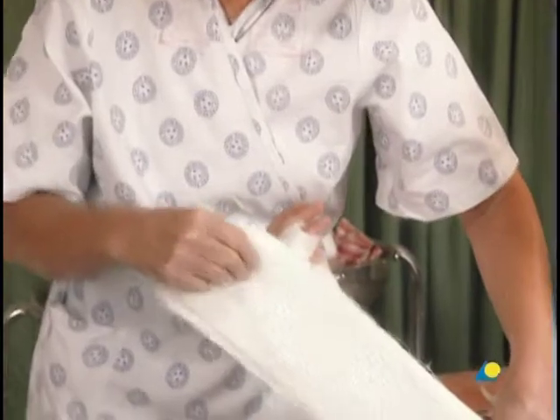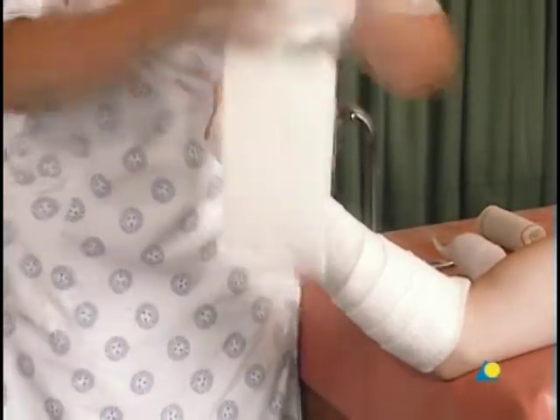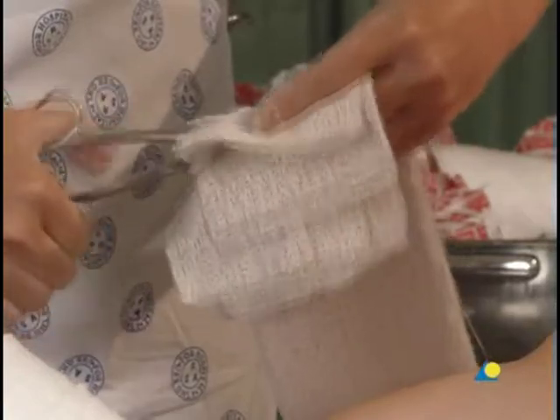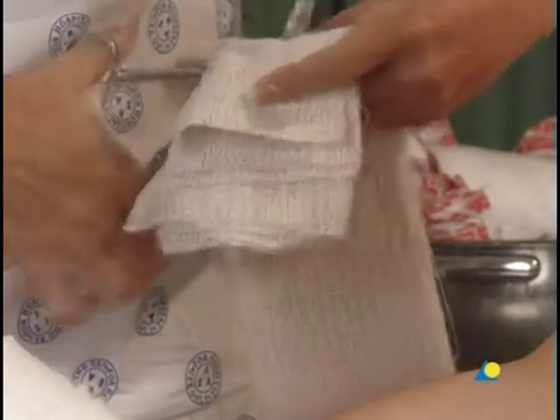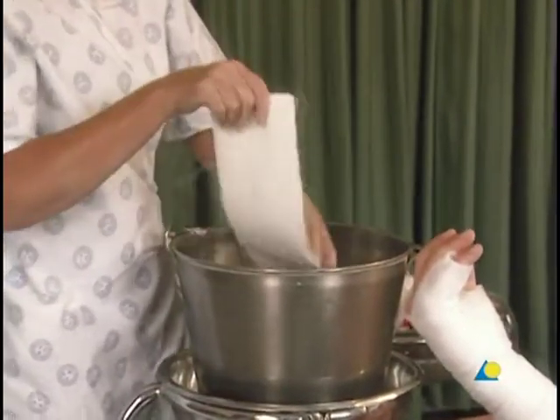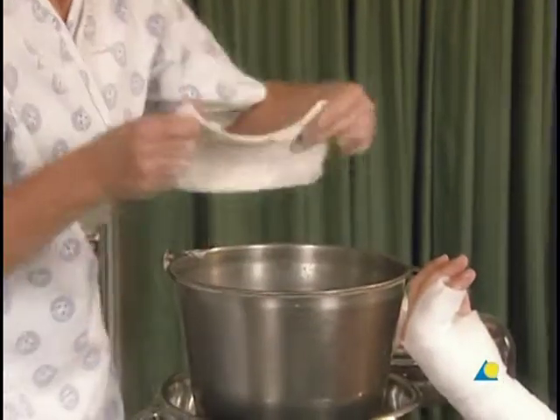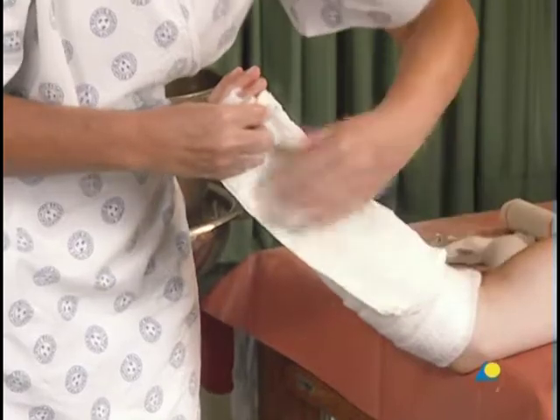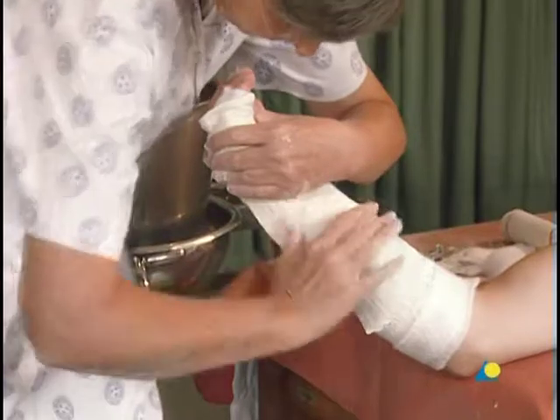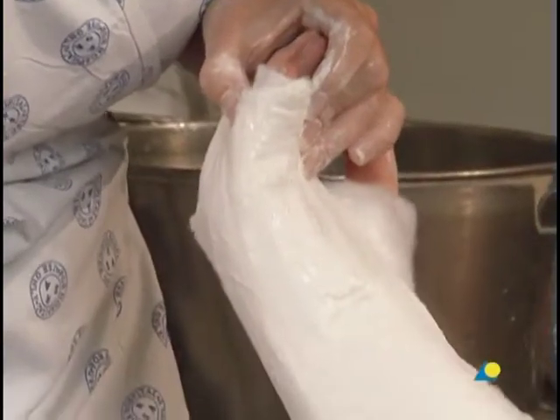The length of the slab is determined using the PIP joint as a landmark. The slab is then cut to length. The slab is wetted by pulling it through the water, and the excess water is removed by squeezing it. The slab is applied around the fifth finger and ulnar side, forming a gutter or channel. The splint should be well molded to maintain the reduction, with support under the metacarpal head.